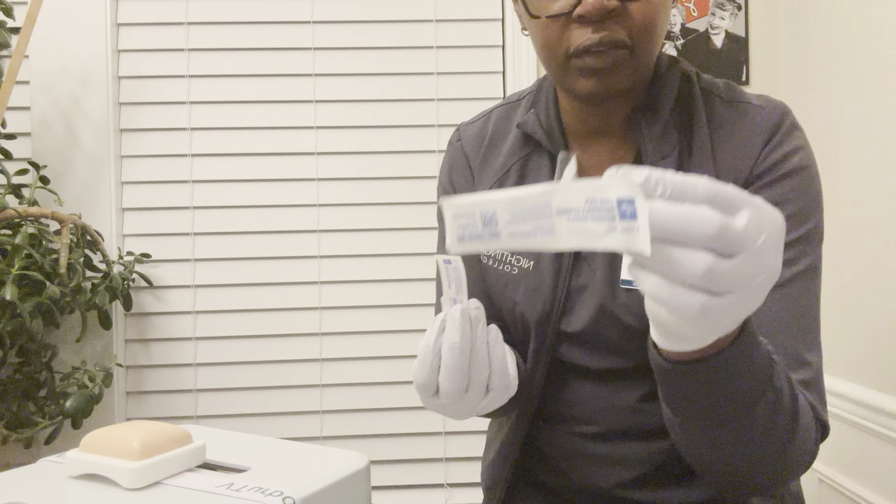So I'll go ahead and take hold of my syringe, remove it from the packaging, put that in the trash, and I'll be careful. I'll only hold the barrel, and I will twist this all the way tight. I'll go ahead and remove the cap with the cover.